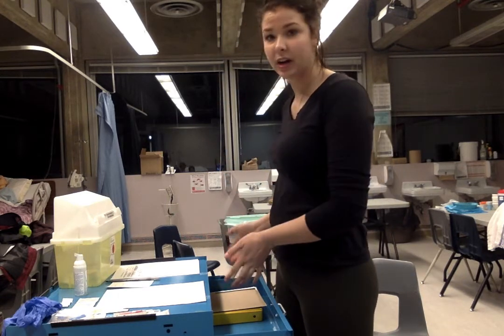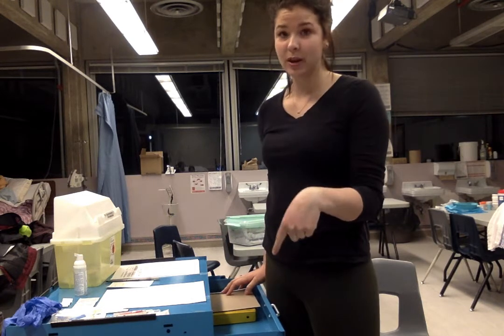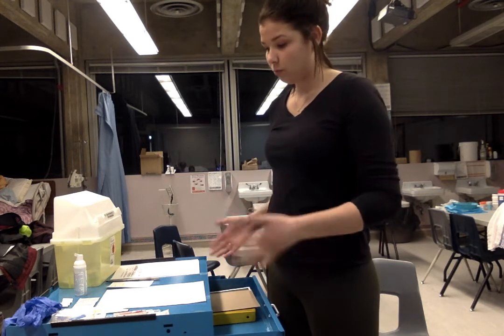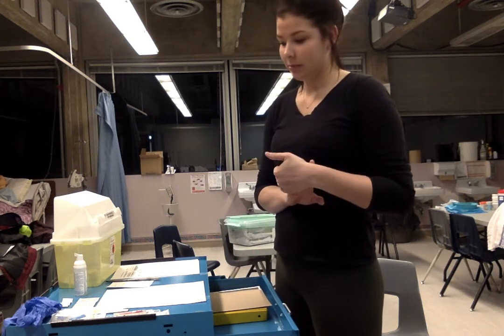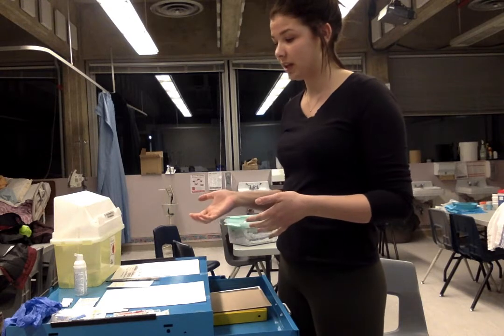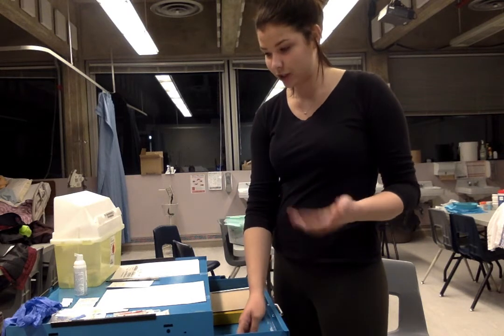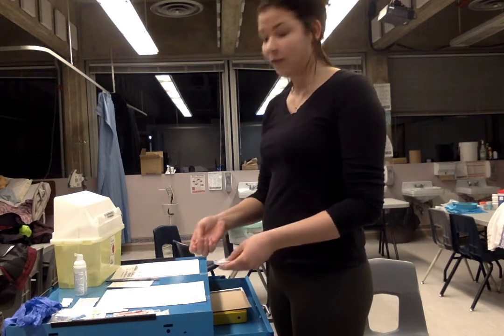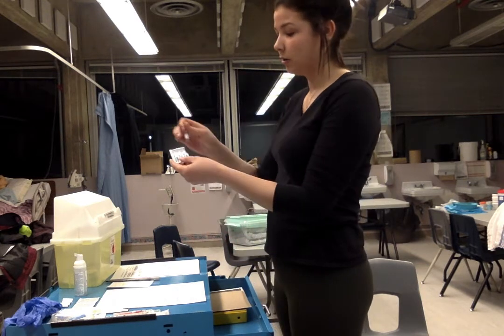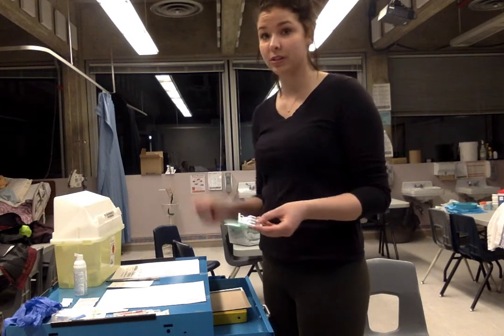Now, there is a narcotics sheet. It's in the other med drawer. We have the fake one, so we're just going to verbalize. So I'm going to need to sign out that I am taking out drugs. I also need to know how much the last person said there was to how much there is now. So on the sheet, it says that there should be 4 left. So I got 1, 2, 3, and 4, and I'm going to take this one out. So now I'm going to record that there's 3 vials left.